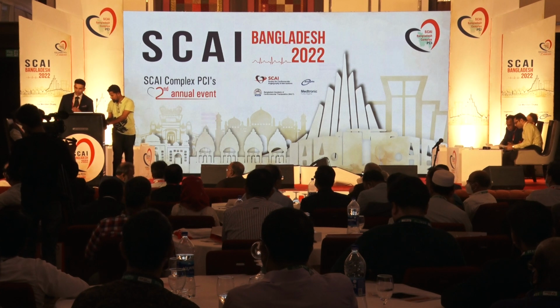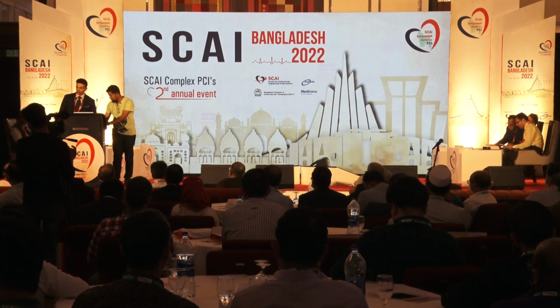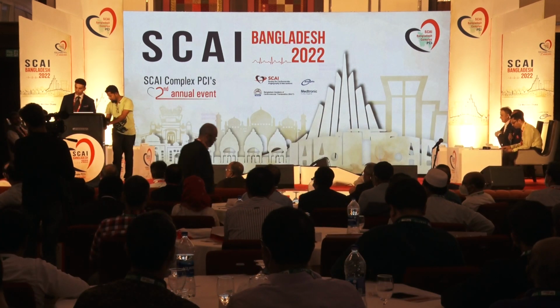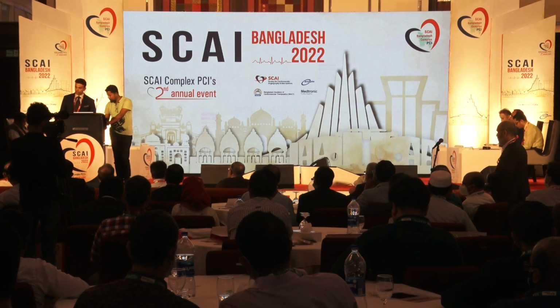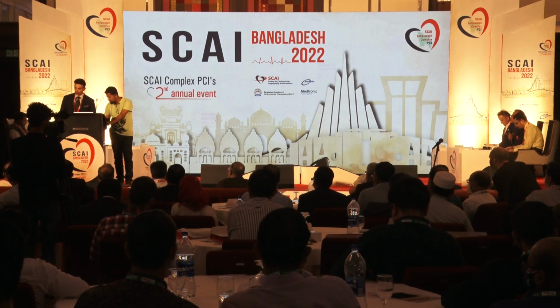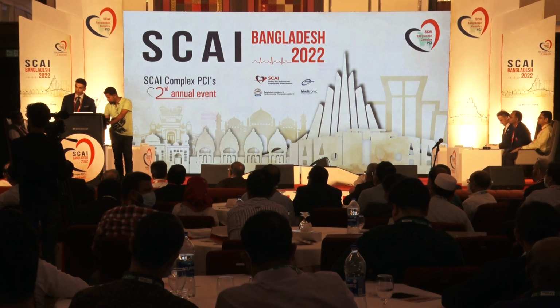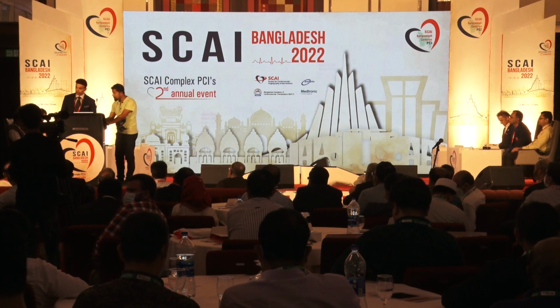Yeah, so I have thoughts on that. That's a very advanced question from obviously someone who knows a lot about this area. Do you use a kissing balloon inflation at the end in your provisional strategy, or don't you? And I think ultimately, to me, that comes down to using the same criteria the definition put forward, which is if you have an impediment to flow into your side branch, given that at bifurcations that's where you get eddy currents and that's where you end up getting restenosis, you're obligated to relieve that obstruction. You can use physiology to define whether or not you need to do that, and that's typically my approach.